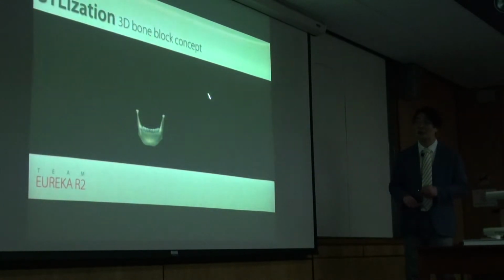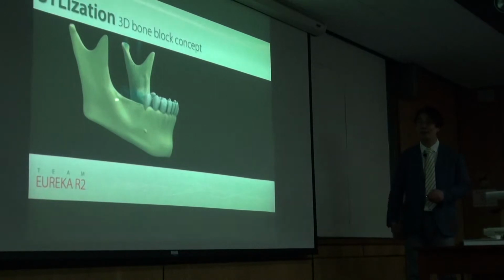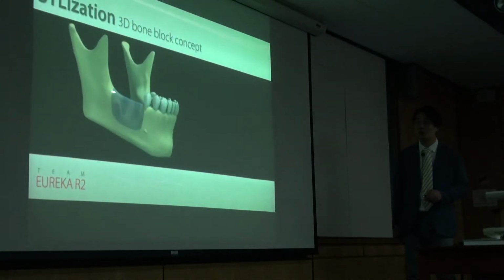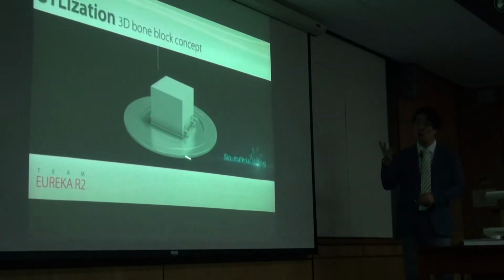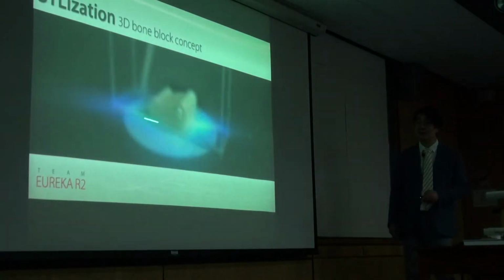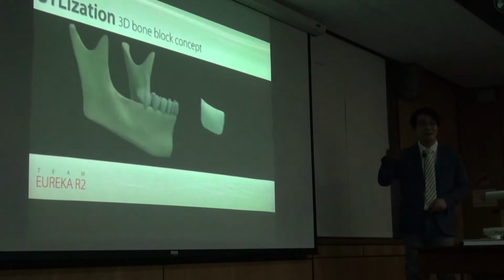So this is our team's future implant concept. Taking a CBCT, after that making a virtual planning like this, and then we can draw the bone and put out the STL files, and we can make the bone blocks. Nowadays we are interested in 2 ways. One is milling, the other is 3D printing. So actually, our group has interest in the 3D printing systems.